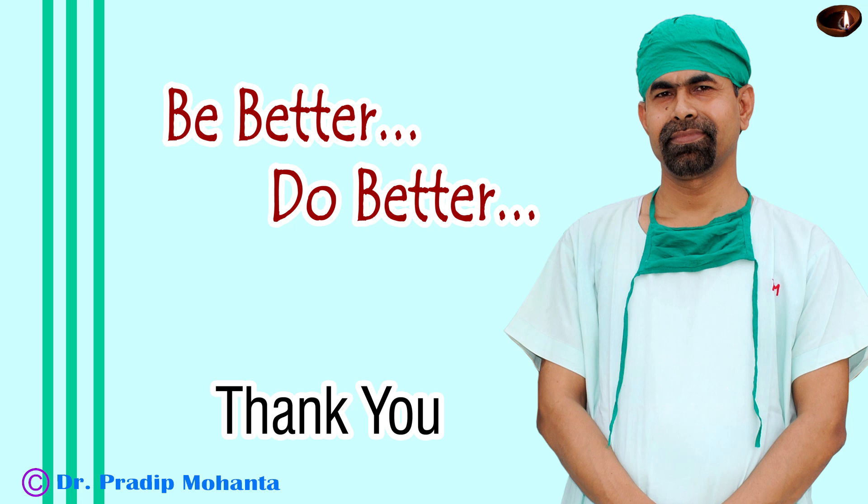The case is concluded. Thank you very much for your attention. I hope this video will help you in developing your surgical skills. Be a great surgeon and serve your patients with love, respect, compassion, and great surgical competence.